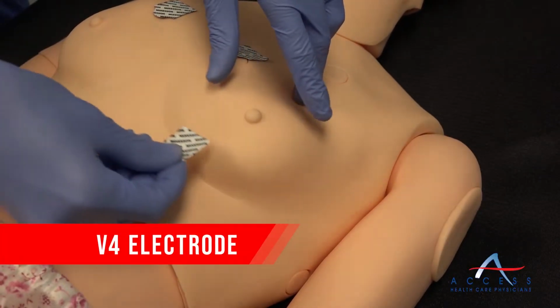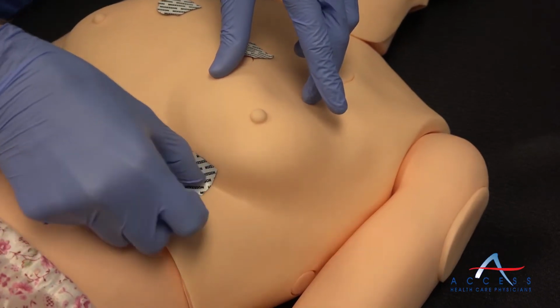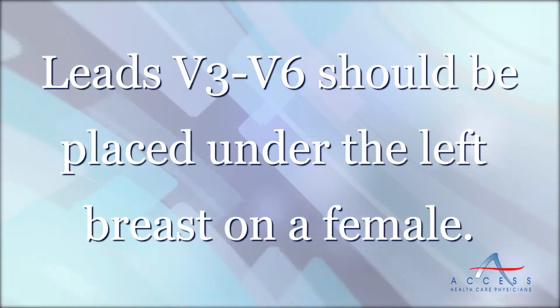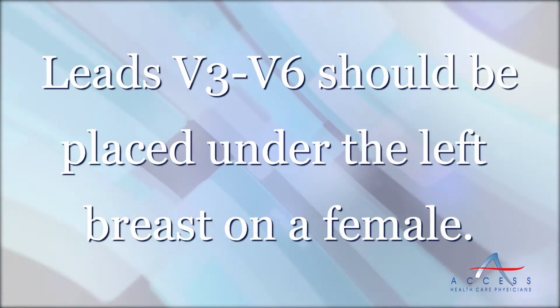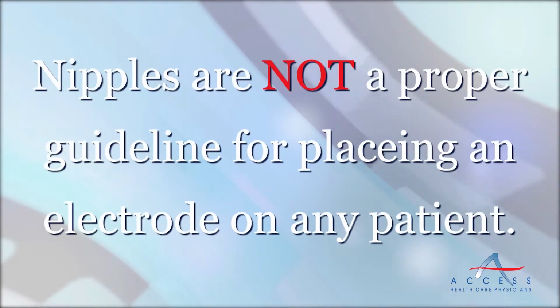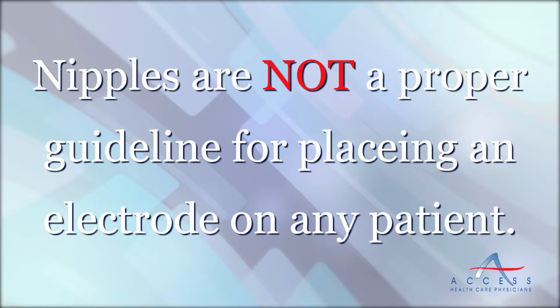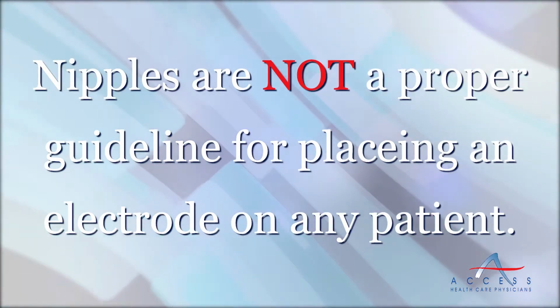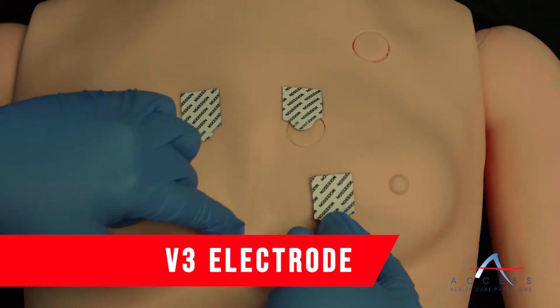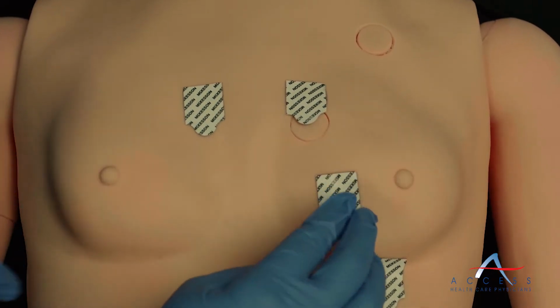The V4 electrode should be placed on the 5th intercostal space at the mid-clavicular line. However, please note that for female patients, V3 through V6 should be placed under the left breast. Do not use nipples as a reference point when placing electrodes for either men or women, because nipple locations vary from person to person. The V3 electrode should be placed midway between the location of V2 and V4.